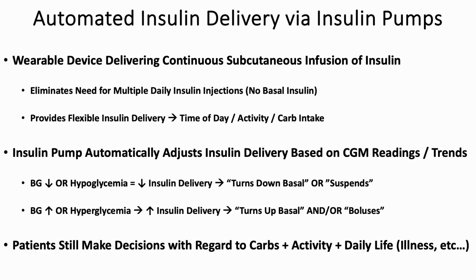Patients can still make, with most of these systems, decisions based on their carbs, their activity, and their daily life. Of course, the ideal system is where patients put the pump on and they don't have to do anything. It's getting closer or moving towards that, but we still do not have any pump that patients are able to put on and then not interact with anymore. They still have to interact with their pumps. So just be aware of that.